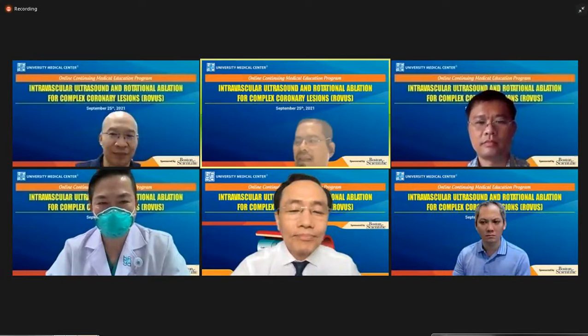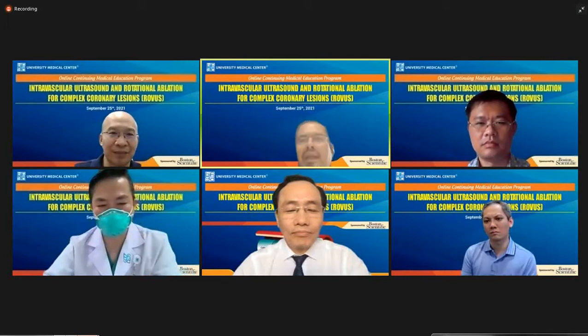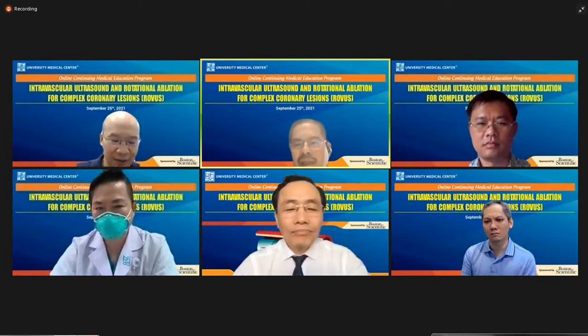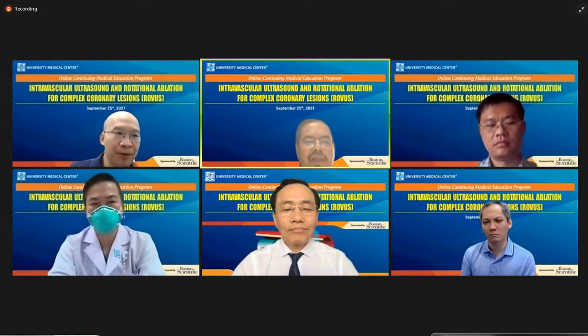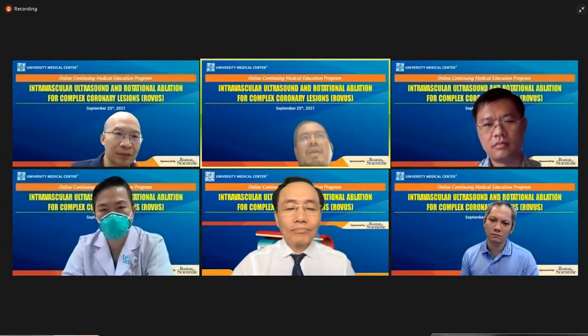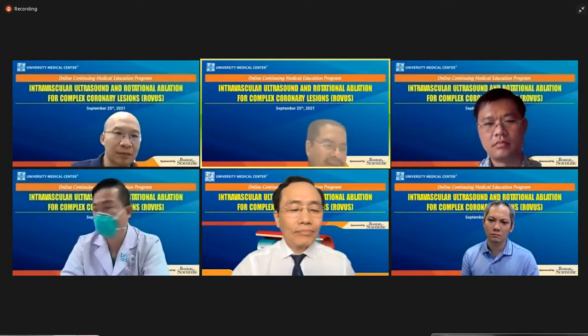For me, I think I'm similar to Professor Bing from the very beginning. We try to keep everything simple because for the future, the patient usually comes back when he's older, and then we still have more chance to work with him later on. So as long as we do the PCI, I try to keep it as simple as possible. So I still prefer provisional stenting. However, I have to say that everything you already prepare carefully, then the outcome should be better. So just follow the plan. Thank you.